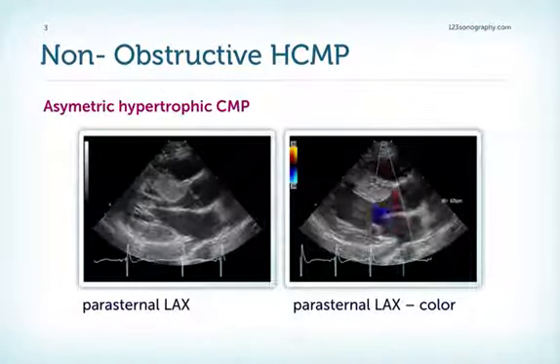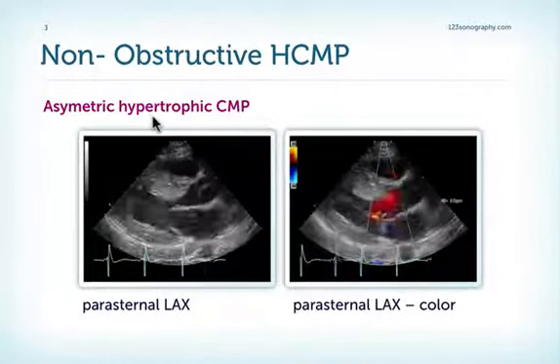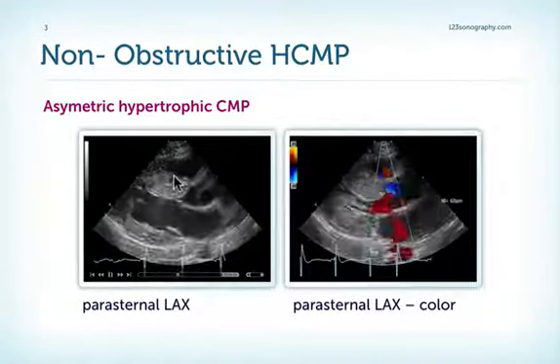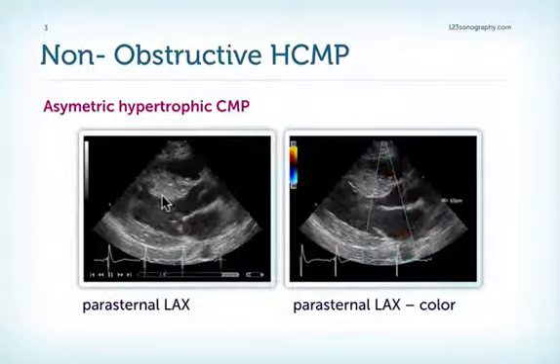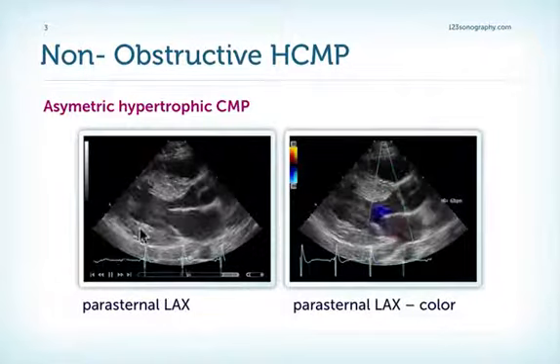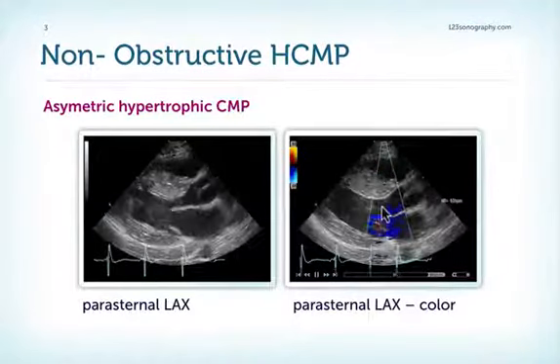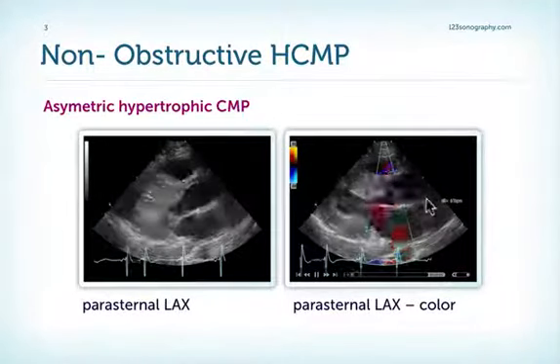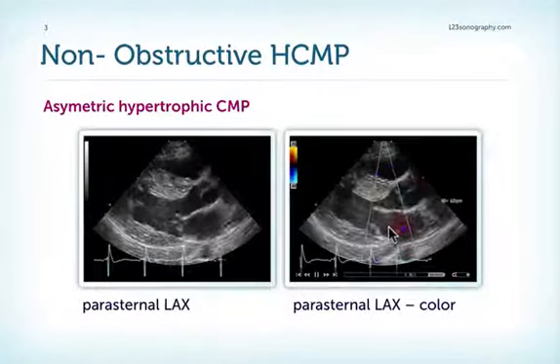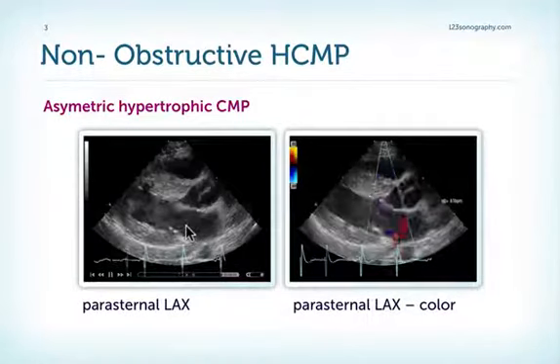First, I would like to discuss the non-obstructive types of hypertrophic cardiomyopathy, specifically the asymmetric hypertrophic cardiomyopathy. This is such an example. You can immediately see that the patient has significant hypertrophy, but this hypertrophy is related mostly to the septum and not as much to the posterolateral wall, so it's asymmetric. Also note that there is no obstruction in the LVOT, so we do not have turbulent flow with color Doppler. There's only minor mitral regurgitation present, and we also have a normal motion of the mitral valve.